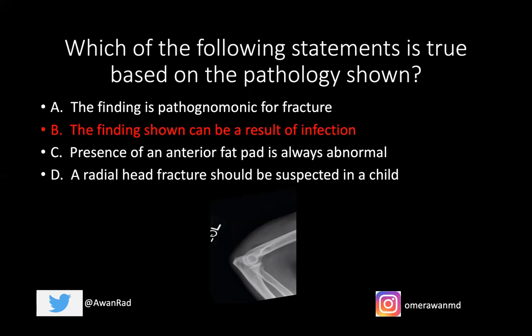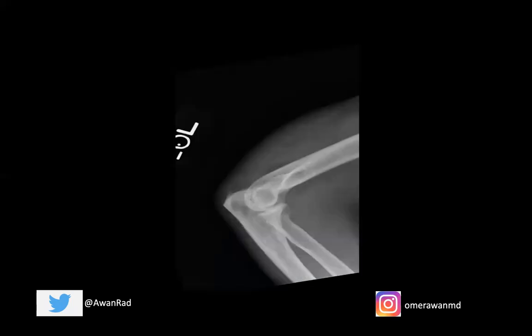The true statement here is that the finding shown can be a result of infection. If we take a look, we have the presence of an anterior fat pad. This anterior fat pad, which is this triangular lucency or dark area here, is enlarged and displaced somewhat anteriorly. This is known as the sail sign, because it resembles the shape of a sail on a boat — an enlargement or anterior displacement of the anterior fat pad.